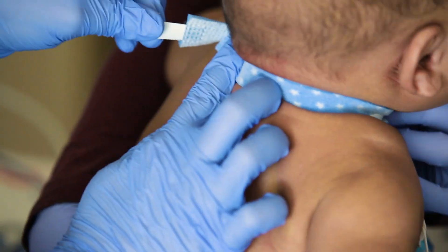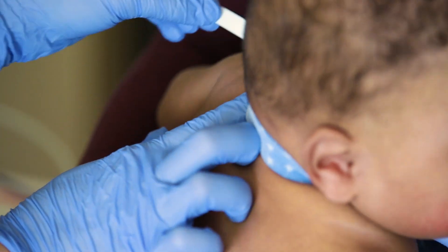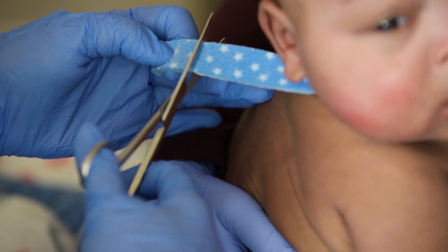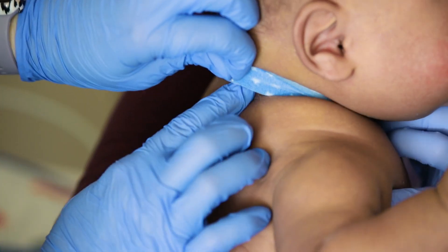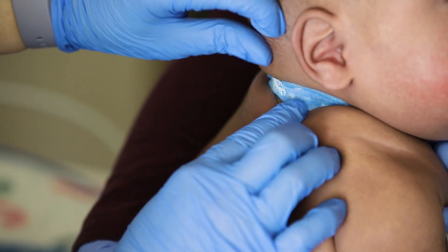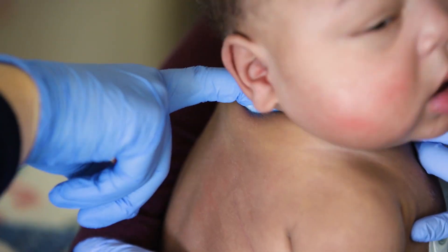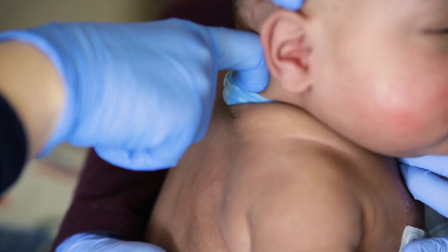Bring the two ends of the ties together at the back of your child's neck and measure the length. Trim any excess fabric away, then securely fasten the ties. It is important to check that the ties are tight and secure — make sure only one finger can fit between the ties and your child's neck.